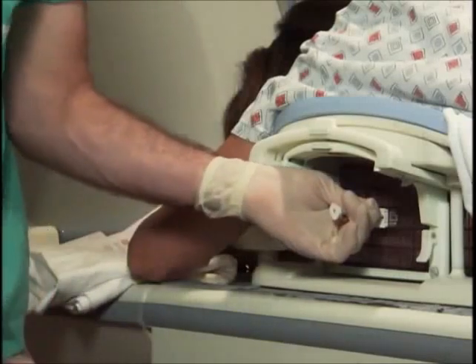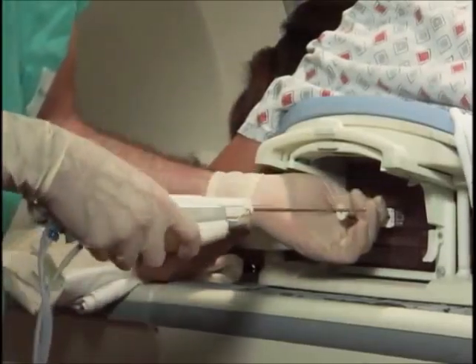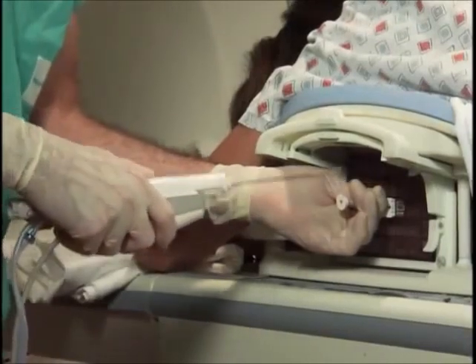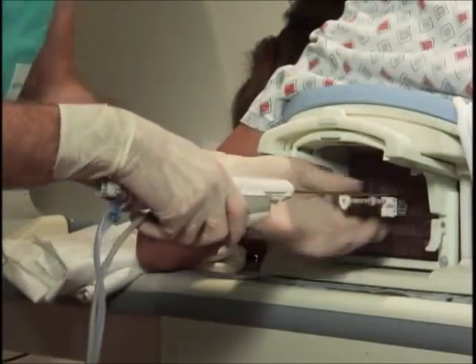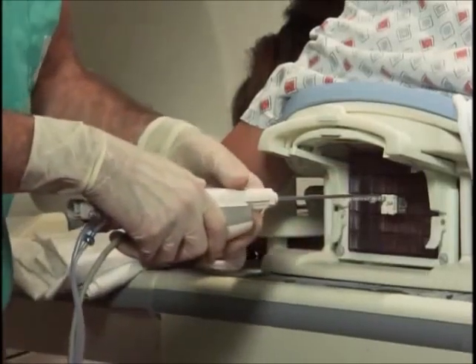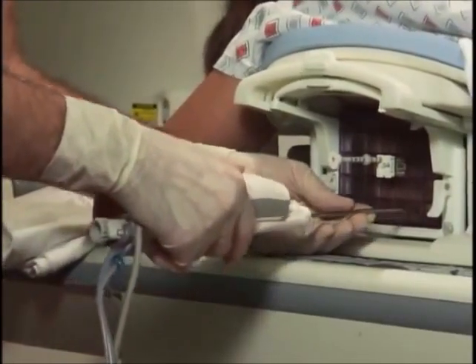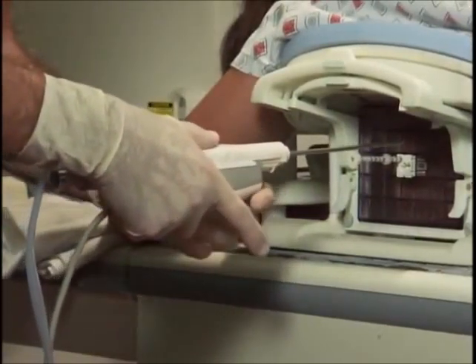Remove the obturator. You'll then receive the Centerex biopsy gun. The mechanism for running the gun is in a standard position oriented inferiorly. With this orientation, 12 o'clock denotes superiorly towards the patient. This allows access in very superior lesions with very little clearance needed to get the biopsy gun past the grid. Alternatively, if you had an inferior access you were trying to make, you can switch the position of the collection chamber so that it remains dependent and advance the needle in a more inferior position. You have that great degree of flexibility as far as moving the actual mechanism so it's not impeding your entrance.